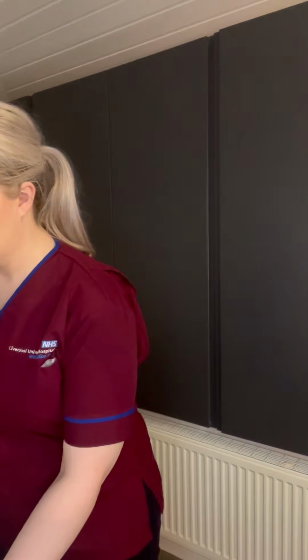So what you want to do is get your insulin and ensure you're following the correct meds management policy, and it's the right patient, the right time, the right medication, the right route. And make sure you've checked their allergies.